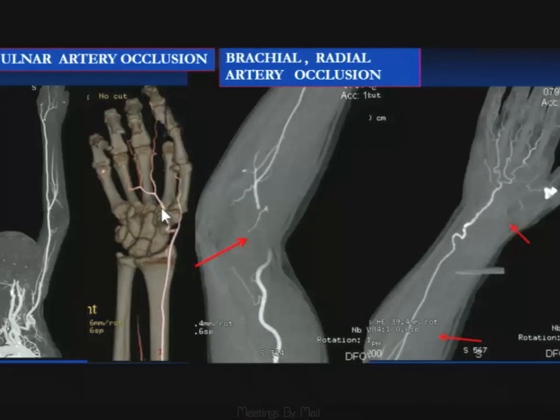So for those of you who've come in a little later, the explanation as to how we're able to get this type of imaging is to do a study where the preliminary determination of flow velocity is obtained by recording arrival time in the aortic arch and arrival time in the brachial artery. That then gives you a time interval difference from here to here that allows you to calculate the flow velocity. You then set the table speed equal to the flow velocity. You have the arrival time determined from the preliminary mini-bolus as the arrival time in the region of interest. You add 4 to 6 seconds to that so that you reach a relative plateau.